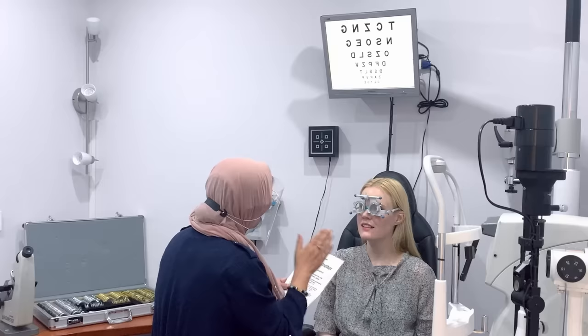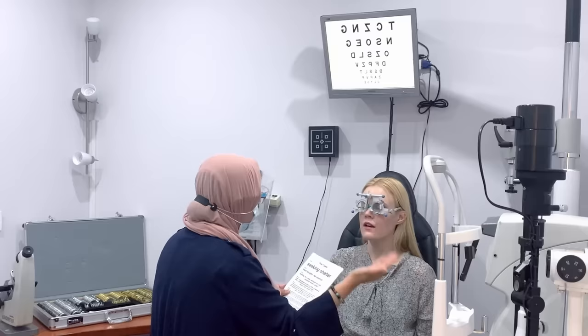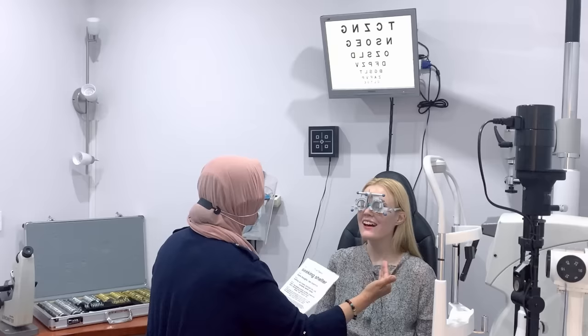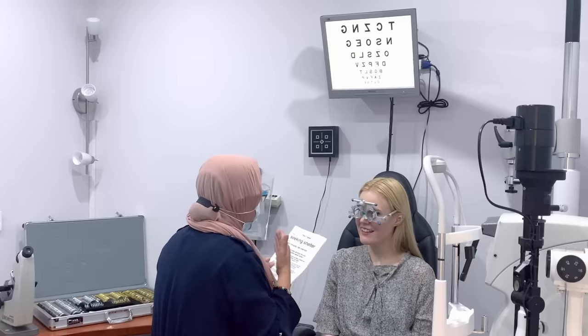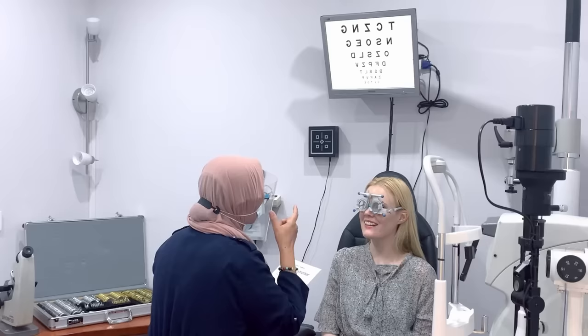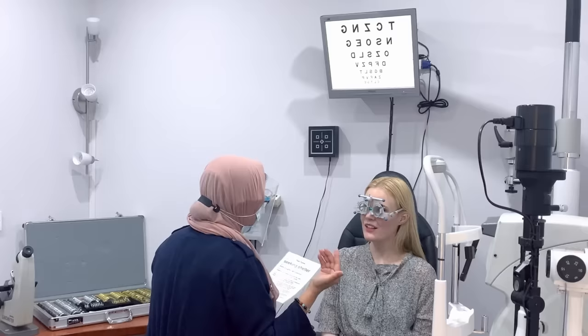But in your case, subjectively, you appreciated it. Normally, I would agree with you. You don't really need it for digital stuff. But it's just beyond what you need, how far you can get up to, yeah? So I'm quite short-sighted. My maximum I can see without my glasses is just here. But anything just beyond it, I suddenly need my glasses. So in theory, I only need it for there. But because I'm so short-sighted, it's to do with what's called the focal length of the lens. It's how far your focal length goes to.